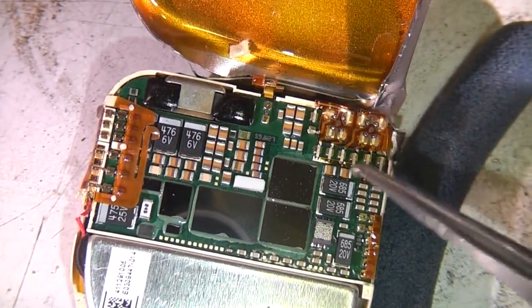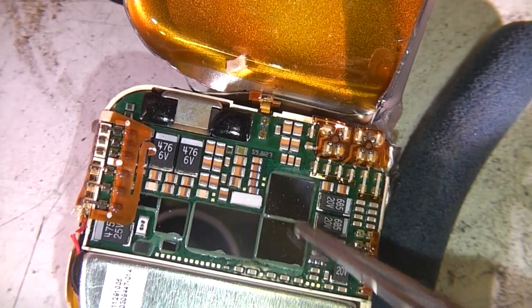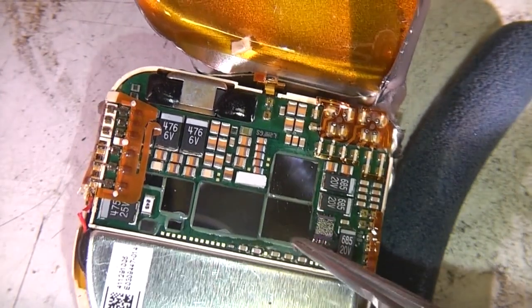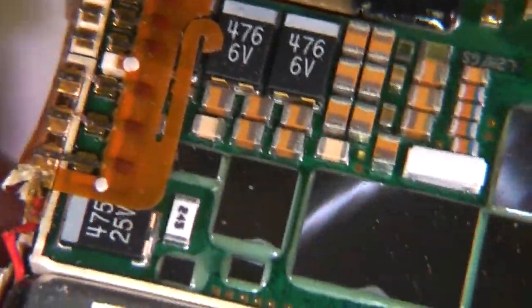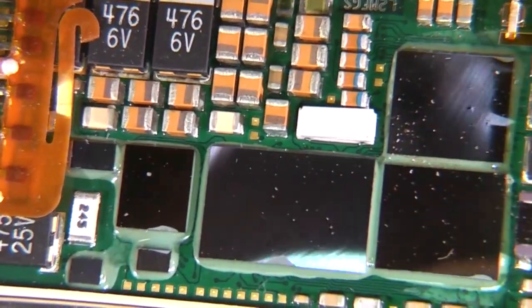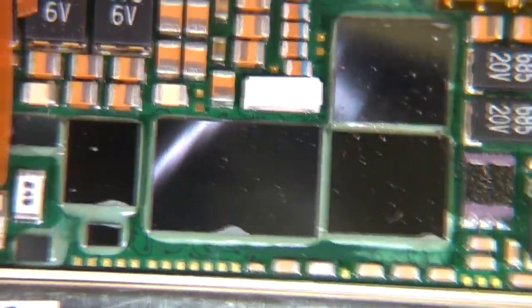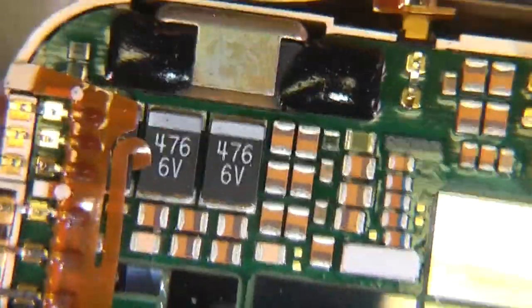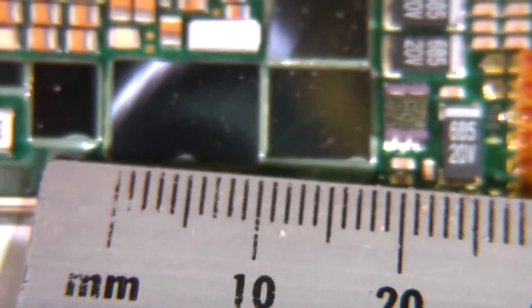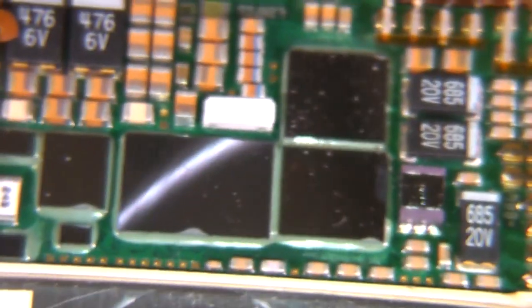And you can see there is quite a lot in here. There's lots of capacitors and a surprisingly large amount of silicon. These are some pretty enormous pieces of silicon really in terms of chips. And that big one there is 10mm wide, and that's a hell of a bit of silicon really.